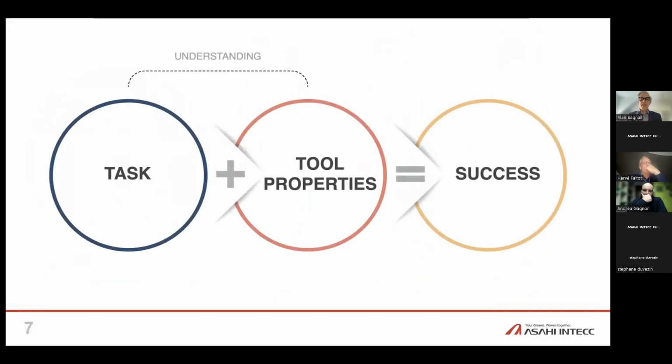Well, the key is about understanding the task at hand, understanding the lesion. That comes from good and careful, detailed analysis of the angiogram first off. The second part of the equation is to understand the properties of the tools that you're going to use. And this doesn't come for free. This involves investment from you into learning this.